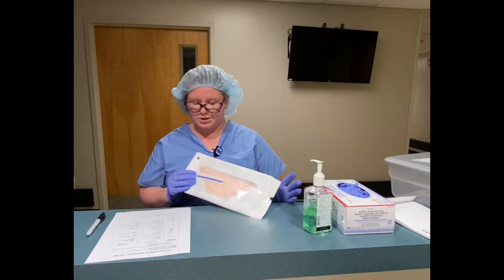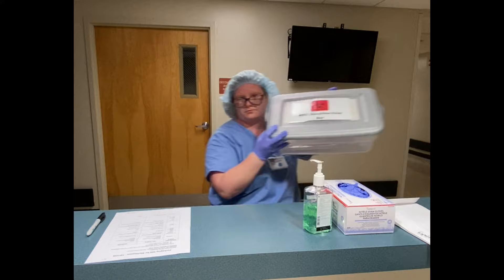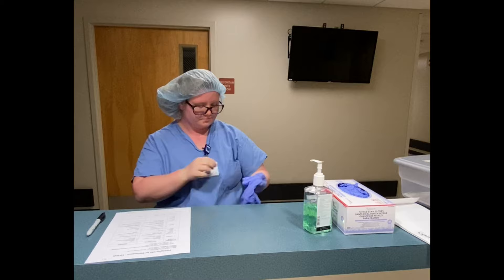Next, deposit in the N95 collection bin. Then doff your gloves and perform hand hygiene, because it's for your safety.